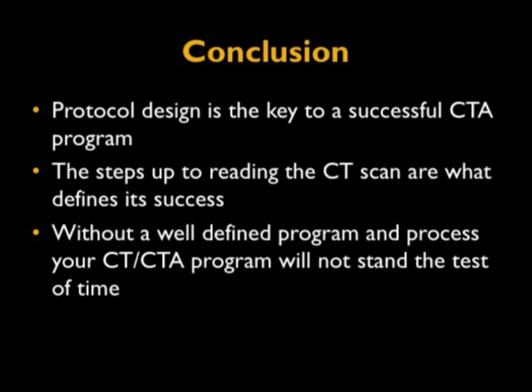So whether it's delivery of IV contrast, whether it's segmenting the data, whether it's editing the data, when it's done, how it's done, every piece of the puzzle is very critical. When you're looking for stenosis, you better understand where you should be measuring. Make sure you have the tools that allow you to quantify things, not just to say it looks like it's narrowed. Is it 20%, 50%, 70%? Those things will often make a difference, whether or not a patient goes to surgery.